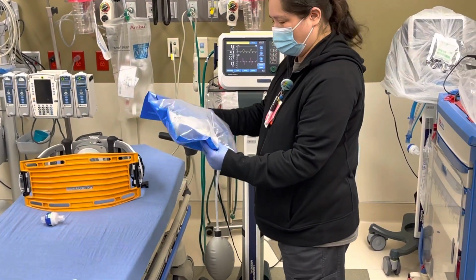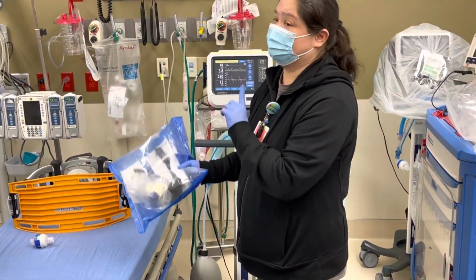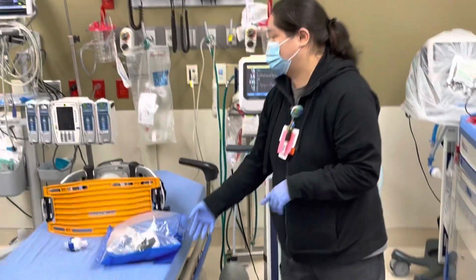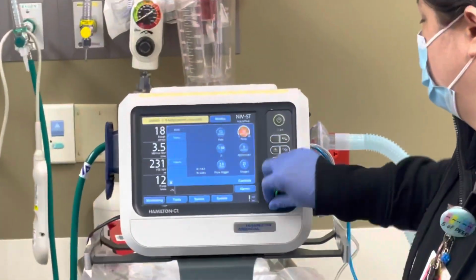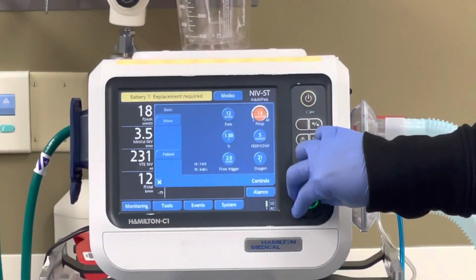So I don't want to do CPAP on this one, but this is going to be BiPAP. If you want to do CPAP on this one, you just click over to CPAP. Yeah, because it won't let me go any further on this one.